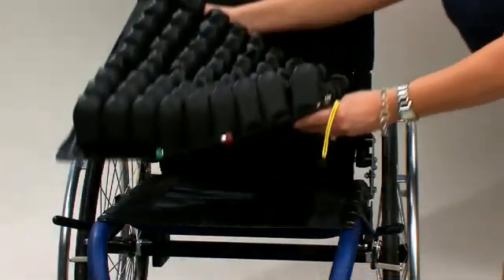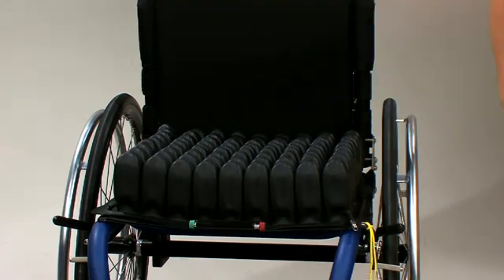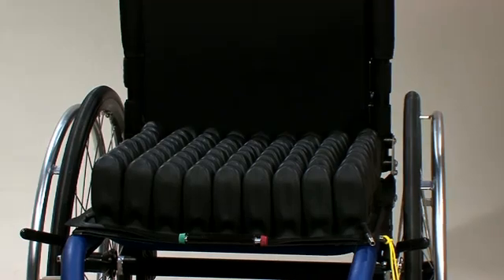With the ISOFlow memory control, the Select series of cushions allow the individual to make adjustments while seated, allowing for an individual's changes throughout the day. Start by placing the Select cushion on the chair, making sure it is centered with air cells up, with the ISOFlow memory control facing forward. Consult your prescriber about alternative positions of the ISOFlow memory control.